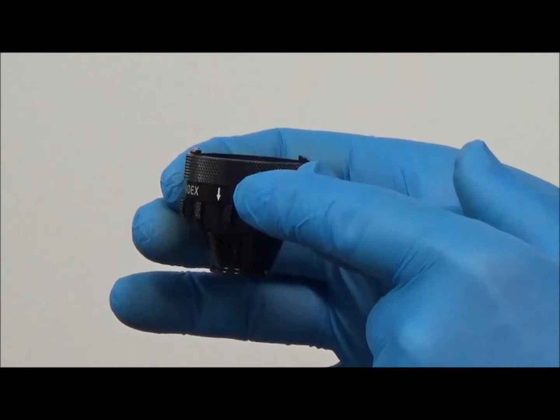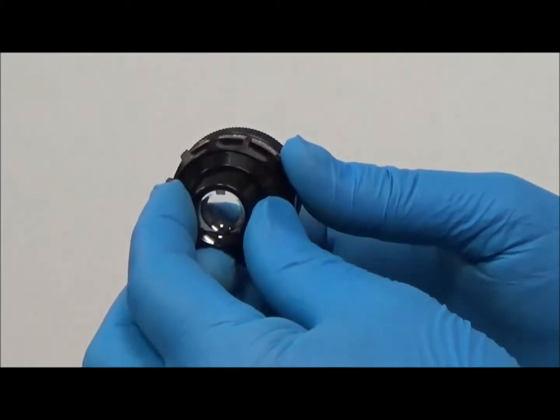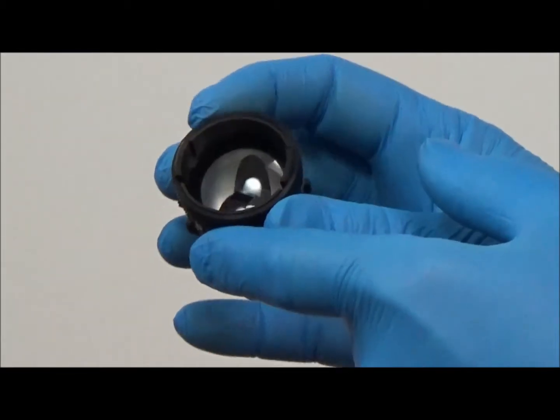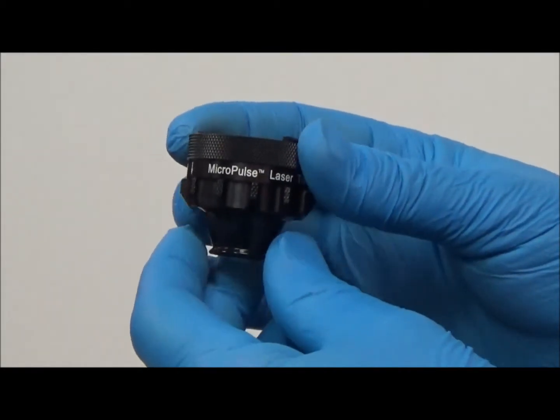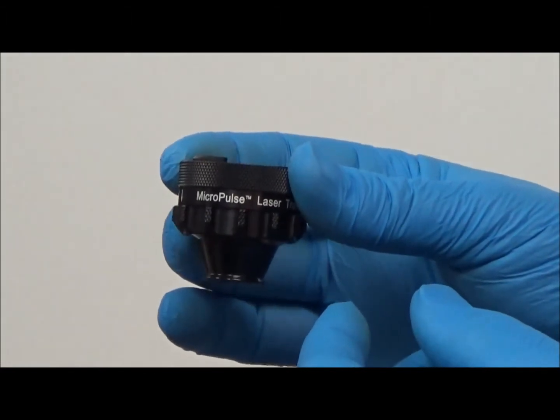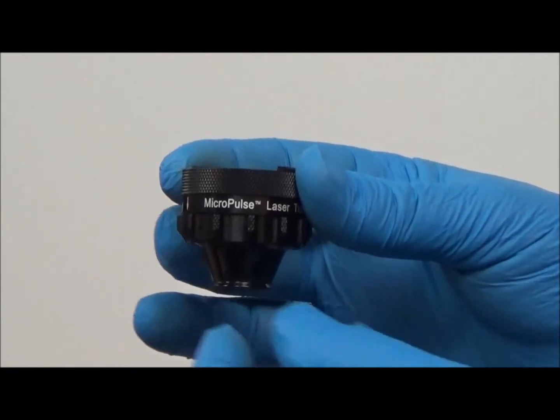For lenses with internal reference bar figures, such as the micropulse laser trabecular plasty lens shown here, a specific angular rotation of the lens is required. The indexing feature and the number of indexing stops, or clicks, for this gonioscopy lens is based on the specific lens, internal reference bar design, and the intended procedure.